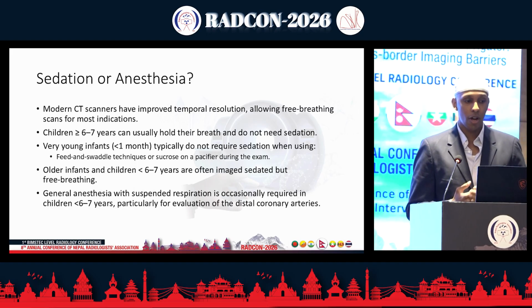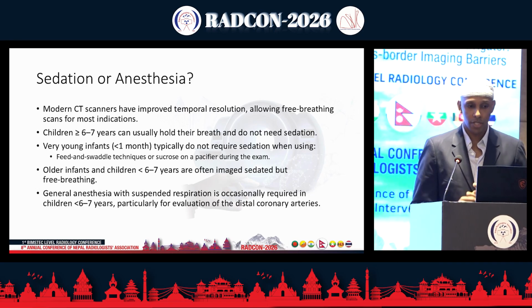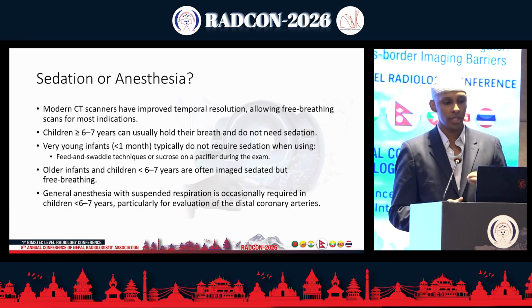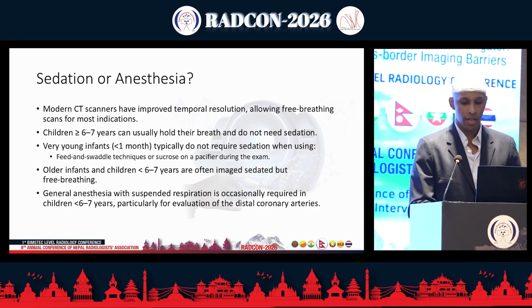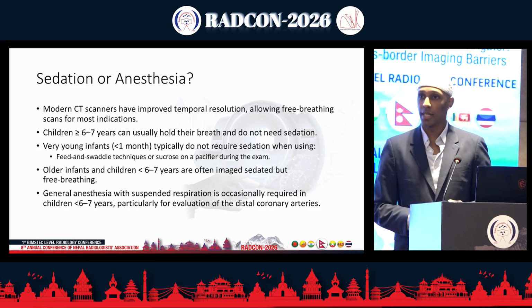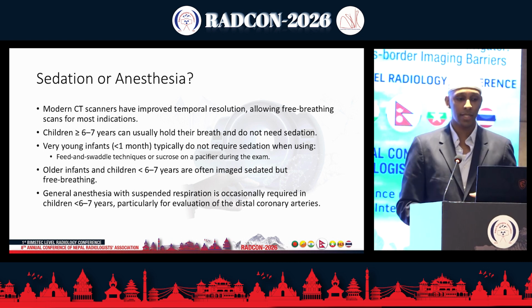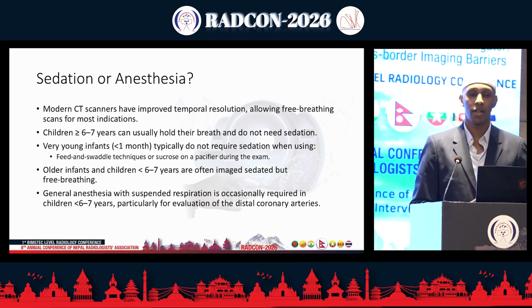Older infants are often lightly sedated but free breathing, and general anesthesia with suspended respiration is occasionally required for young children, particularly for the evaluation of the distal coronary arteries, right? So usually, if you have access to a power injector, EKG leads, and a scanner that's capable, you really don't need anesthesia to be on board in order to do cardiac imaging for the pediatric population.